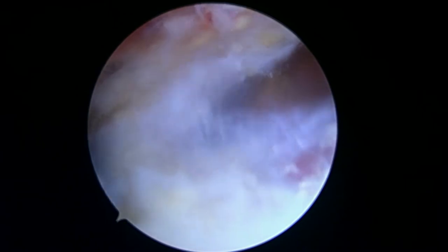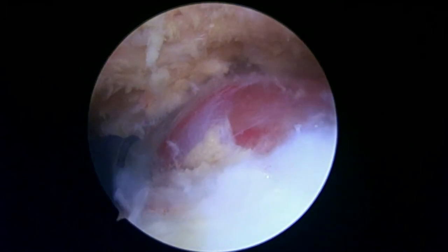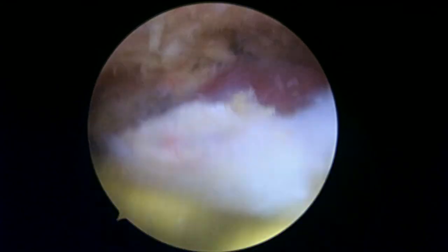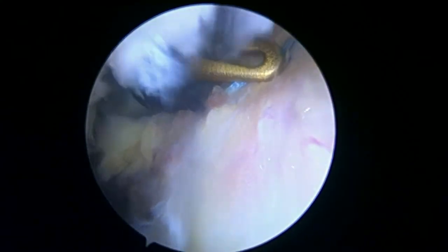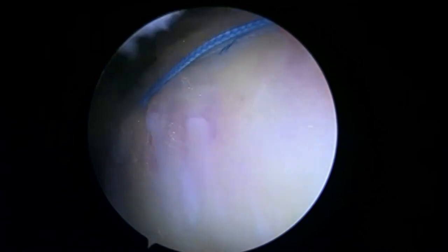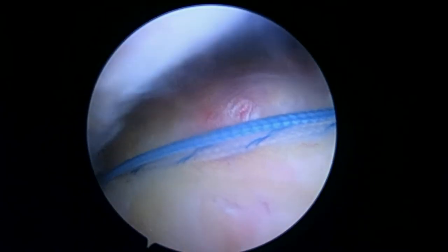Okay, hi Keith. So now we're looking from the back. We've done our decompression, which is our work on the bone spur or anything that could pinch on the rotator cuff, and now we're getting a good look. Hold those sutures snug again, at where we put those sutures in. Here they are here. And the key here is, as I hold tight with the camera, hold still, and rotate your shoulder, there's no sign of any cuff tearing on this side. It was just on that articular side.